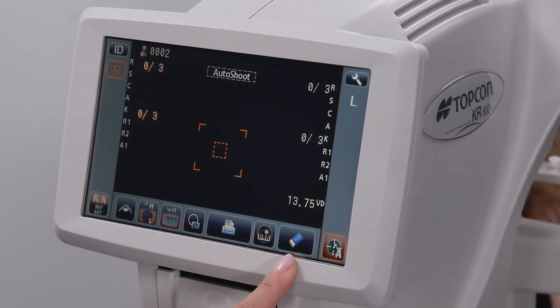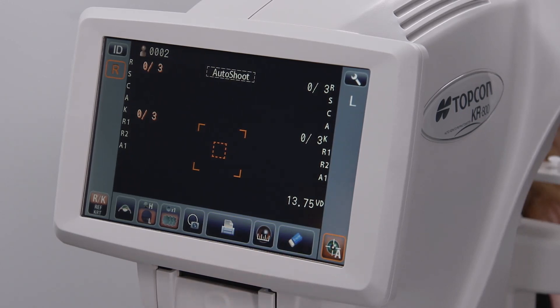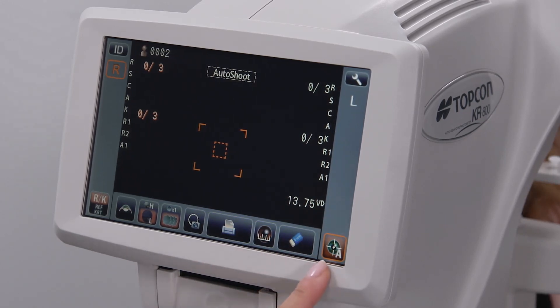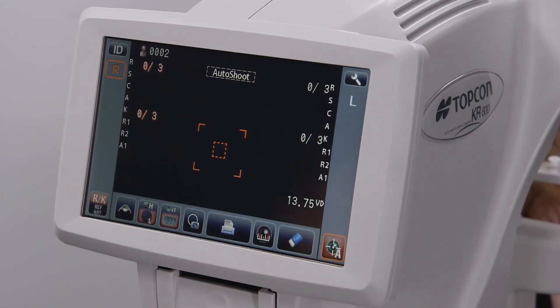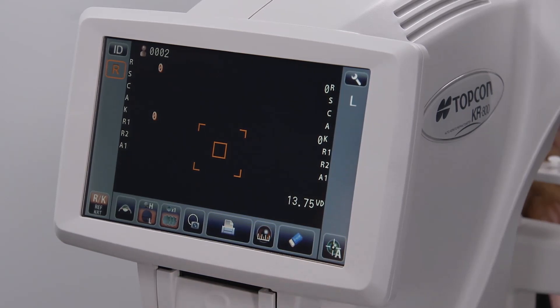The eraser icon deletes all of the data that was acquired on the previous patient. The alignment icon allows the operator to switch between automatic and manual modes. In manual mode, the device will not automatically capture measurements; instead, the operator will need to press the joystick button after aligning the eye.